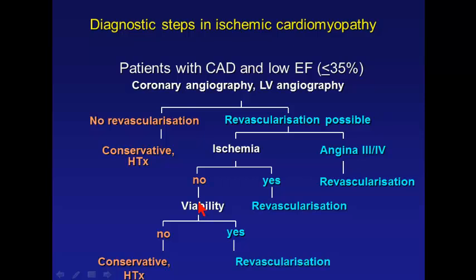Just for the understanding, we do a viability testing, and we do it generally with FDG, and I would like to show you here a little bit of also the advantages of one over the other technique, without favoring one or the other, but there are reasons why we should know about both.